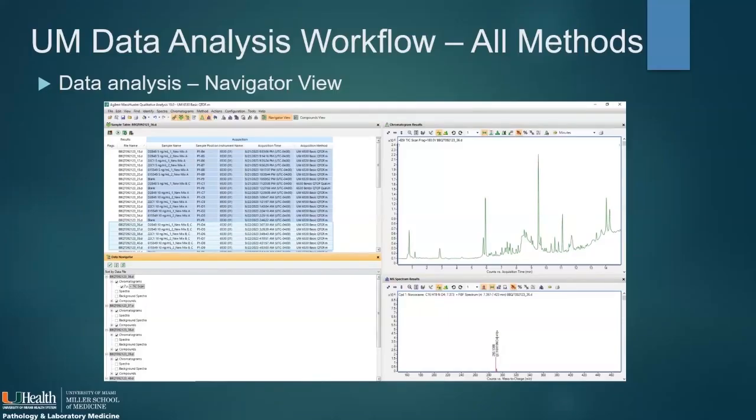We do use this view because we're able to load a tool called a mass calculator, where we put in the molecular formula and it gives us the M+H, the accurate mass to 4 decimal places. And this is where we can do extracted ion chromatograms if we're trying to see if there is a specific compound and maybe retention time has shifted. That's how we maybe look for things in our positive controls that might have shifted. This is also the screen where we look for unknown peaks and try to get their accurate mass and retention time. But really, this is more of an overview page.